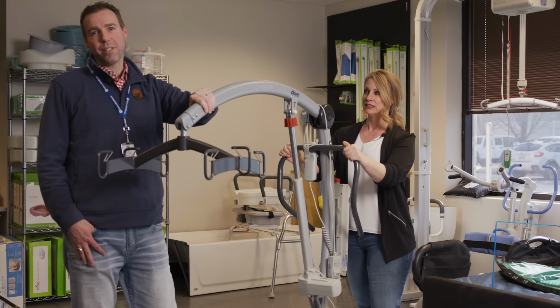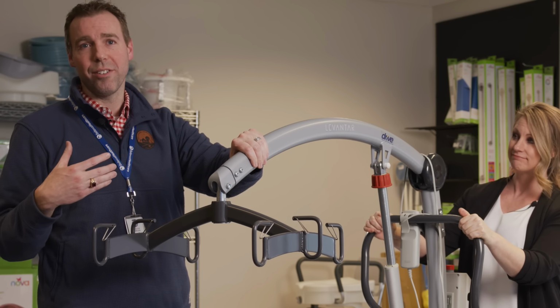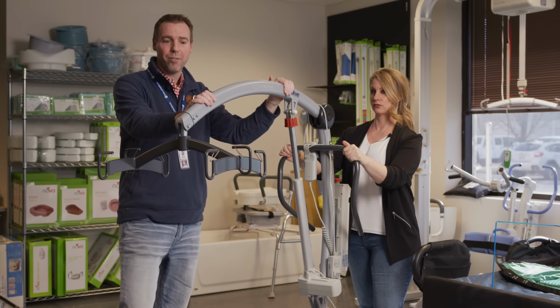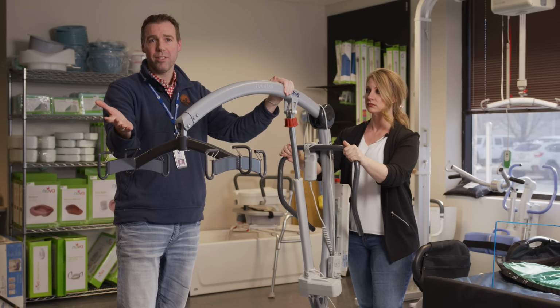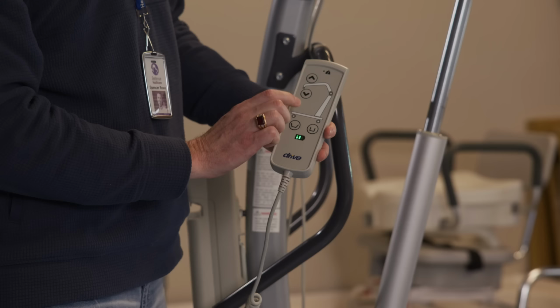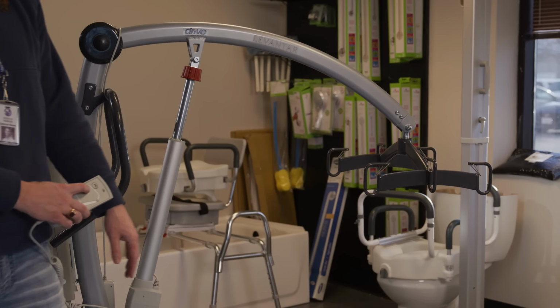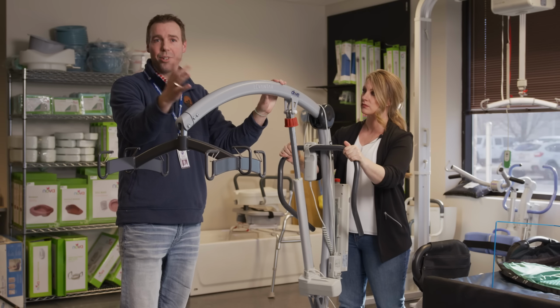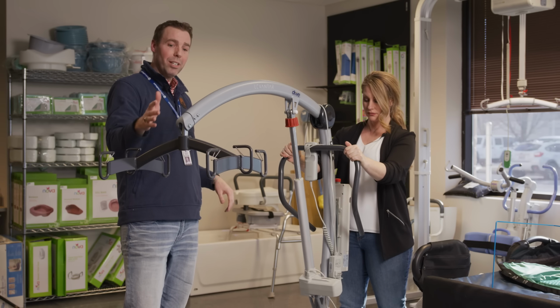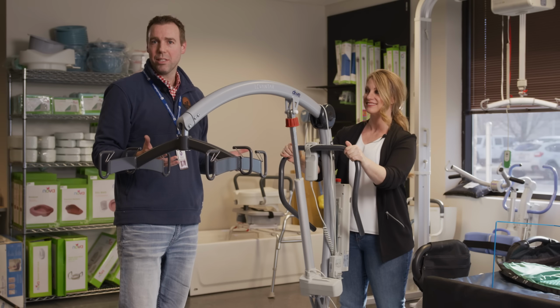As the disease progresses, at some point, the patient will not be able to get up and transfer on their own. So the Hoyer lift is really made for those people who are stuck in bed or confined to their bed without the use of a lift to transfer them. This will get them either from their bed to a commode, or from their bed to the bathroom, from their bed to a wheelchair, so that they can get out and enjoy the day still. But really, this is quite a bit more aggressive looking than the other options that we talked about already.